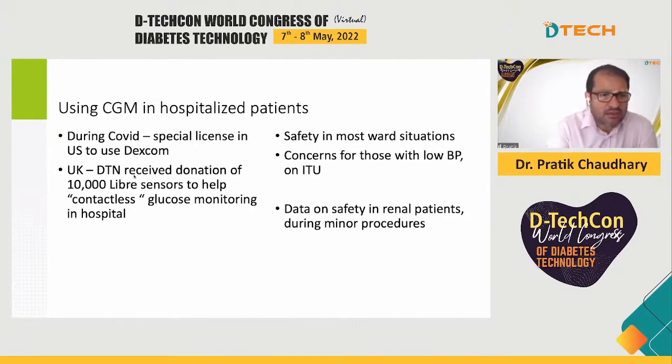And that was a pretty successful story. It also helped with support of patients coming out of hospital where the insulin requirements were coming down. We saw a lot of patients on insulin during COVID that came off between 2 to 4 weeks after, and those sensors really helped for that.